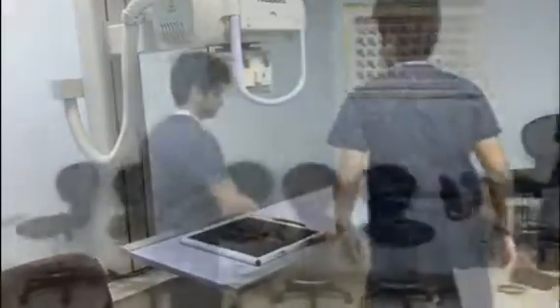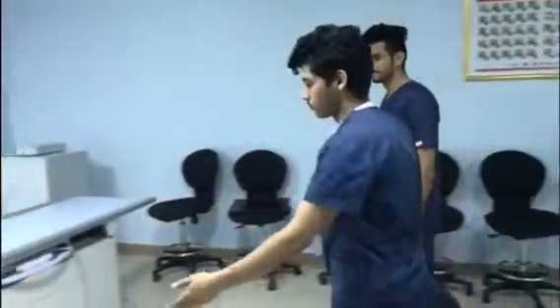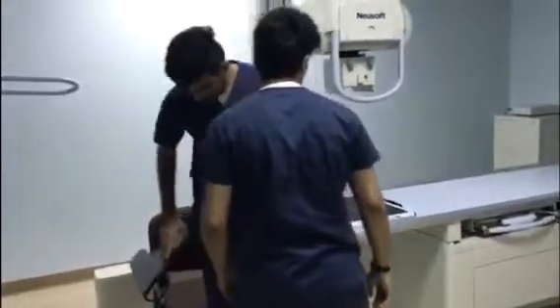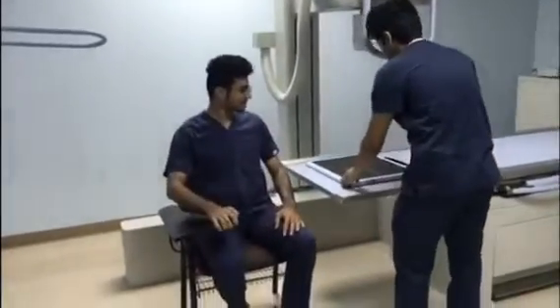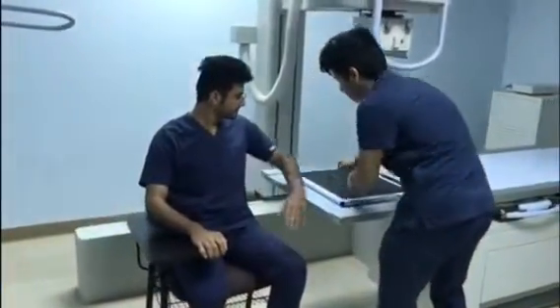The specialist tells the patient to sit on the chair beside the table, and the patient must have a gonad shield.